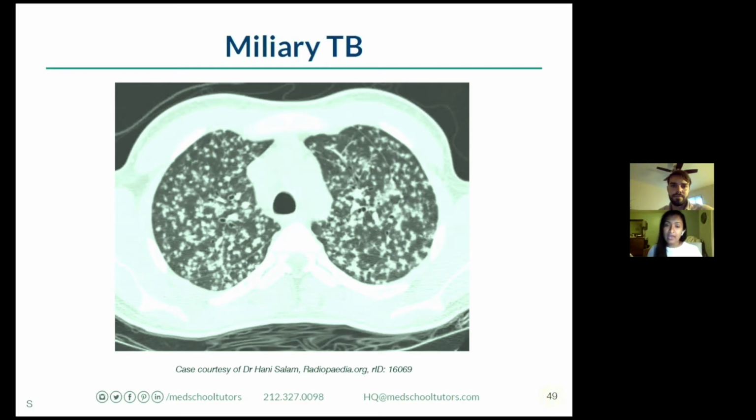Renin-angiotensin-aldosterone system. Because of that, the miliary TB causes destruction of the adrenal glands, and you can see this hypotensive pattern because of the lack of glucocorticoid synthesis. So again, a couple of levels there, but that's how they're going to test you on the USMLE exam. Yeah, thank you, Sana. Very similar to Waterhouse-Friderichsen syndrome and how it affects the adrenal glands there.